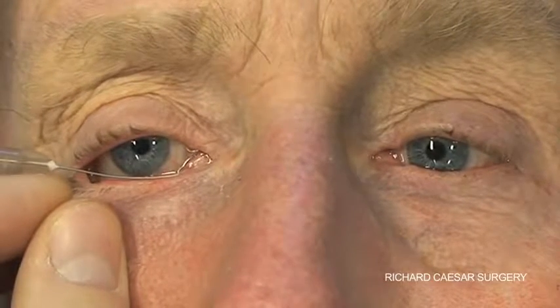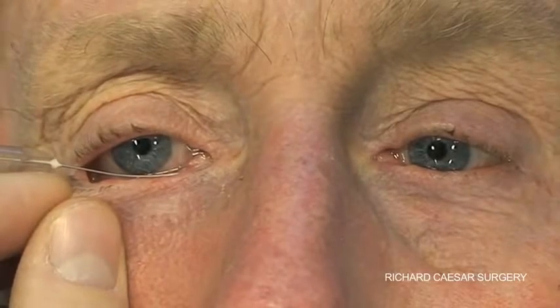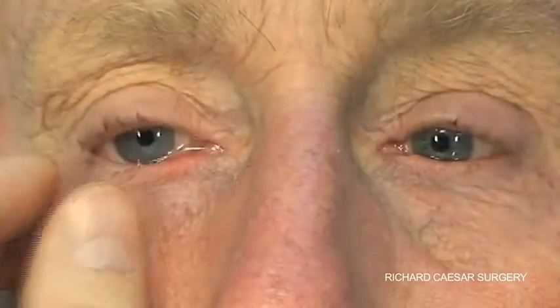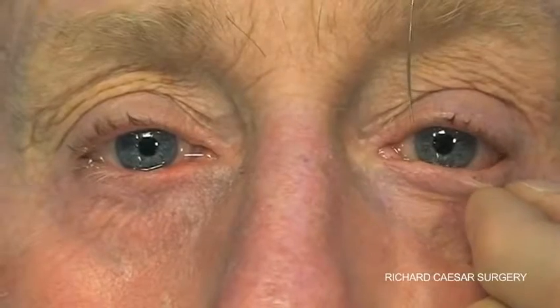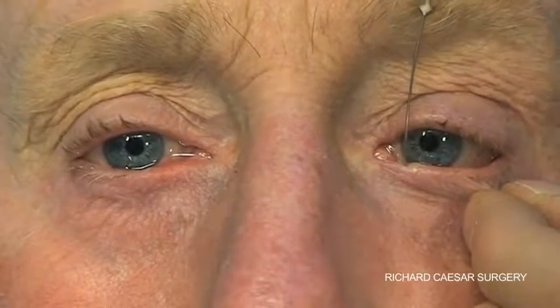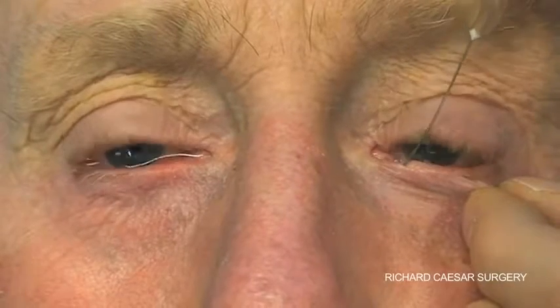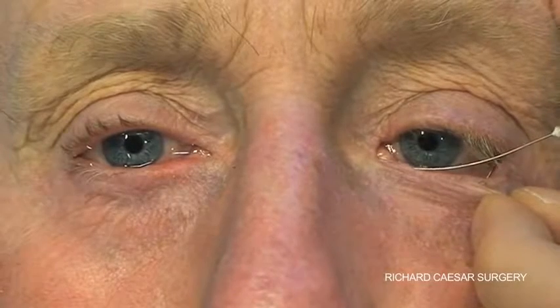The cannula slides into the sac, or reaching a common canalicular block, prior to injecting. There's no need to dilate the punctum and there's no need to use any local anaesthetic. A very gentle hand and a very careful change of direction is all that's required.